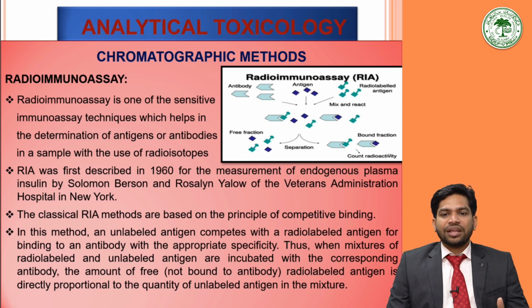These were the very first labels used in immunoassays. They are subsequently detected by scintillation counters. Disadvantages of the radioisotopes include health hazards and special attention required for the handling of the reagents. Disposal of radioactive waste is another problem. Then the training of staff, the short half-life of the isotopes, and expensive instrumentation are certain problems associated with radioimmunoassays.